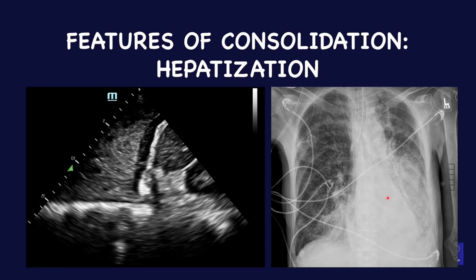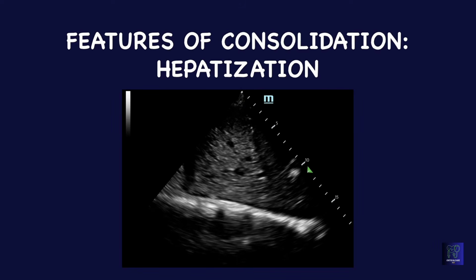Note dense left lower lobe consolidation corresponding to the lung or the left lower lung above the diaphragm here. Here is a zoomed in view of the same finding of hepatization of the lung.